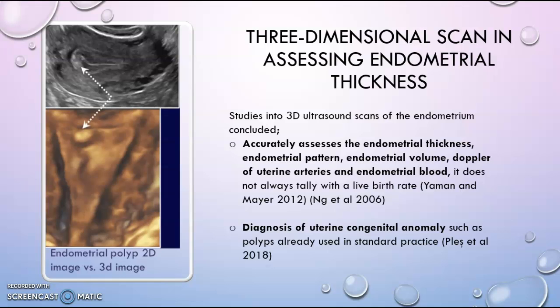In the evaluation of the endometrium, 3D ultrasound is a promising tool, but the literature does not confirm the suggested benefits of this technique, and in accordance with the ALARA principle, this would not be recommended in current practice. The other drawback is that 3D ultrasound probes are expensive, and consequently, NHS fertility clinics may not want to purchase this without clearer benefits in patient care.